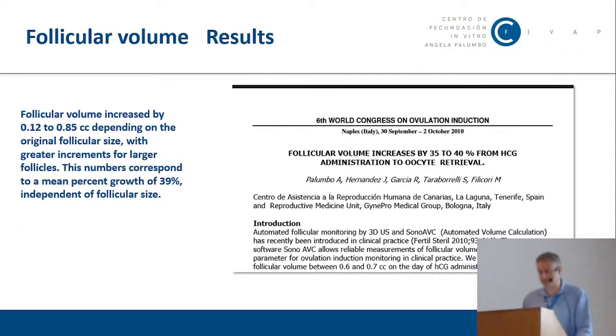We also studied the percent of growth during stimulation, especially between trigger day and egg retrieval. This is very important in determining the chance that with an extra day of stimulation, the follicle could reach the size that we consider mature. In 2010, we presented this abstract where we showed that the average follicle growth was 39%, independent of follicle size.